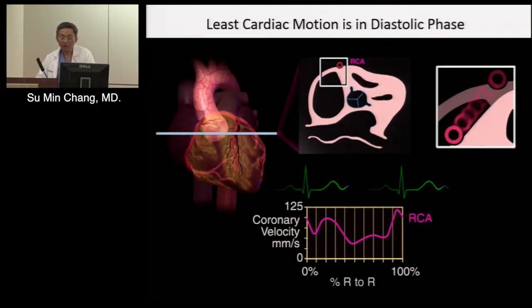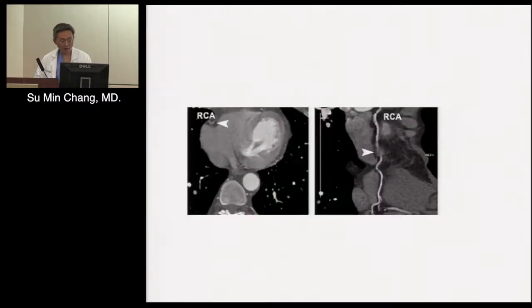When you went to the cath lab, you could see how much the RCA goes up and down and side to side, swinging back and forth. And that motion requires a device that has enough shutter speed in its camera to freeze that segment of RCA for us to be able to analyze adequately. And this is a perfect example.